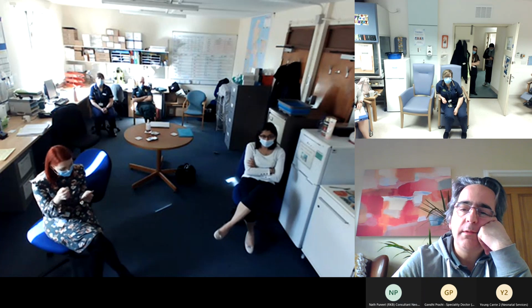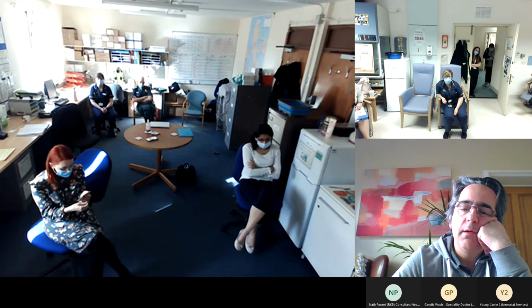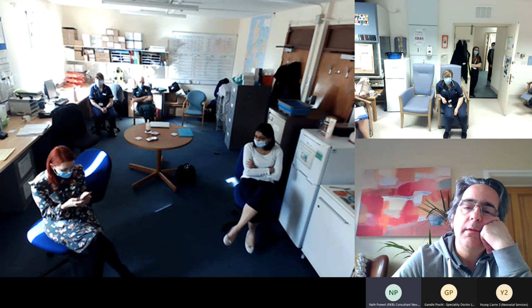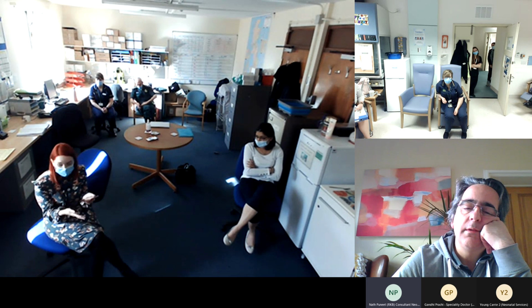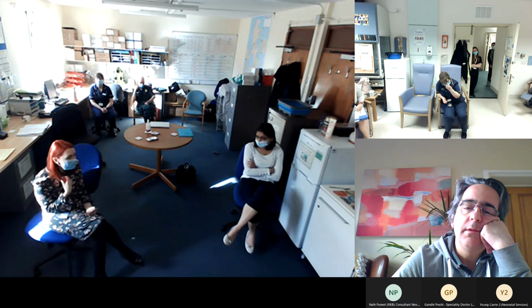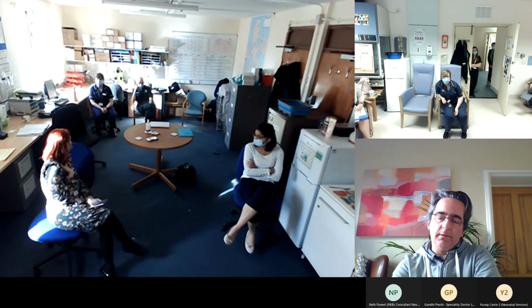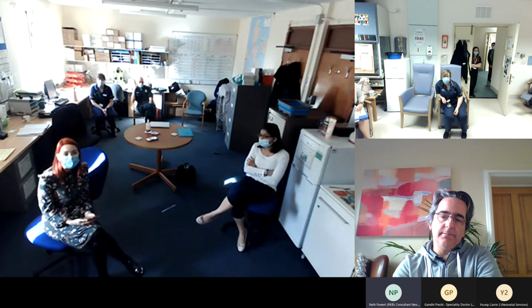Okay. And then the final one, there were a few questions about the positioning of the arm for X-rays for long lines. Artie asked questions that she wasn't aware that flexing the elbow was beneficial, and some radiologists can suggest 90-degree positions of the shoulder joint. So certainly from a nursing perspective, I've never been told to bend the arm that I can think of. I don't know if any of the nurses have been.